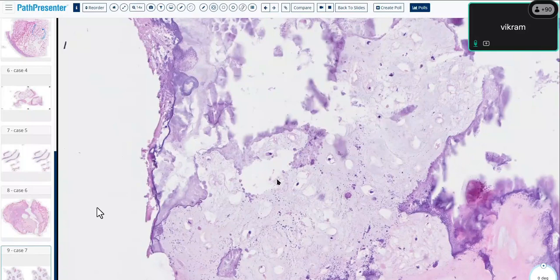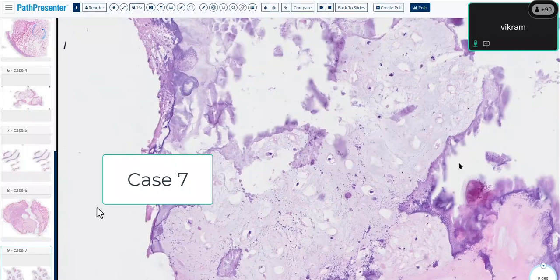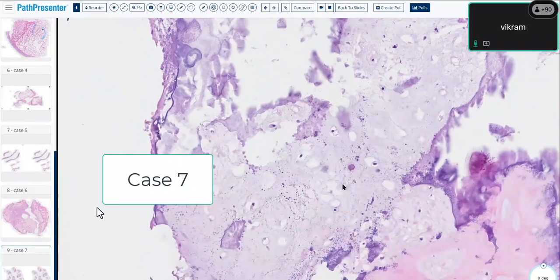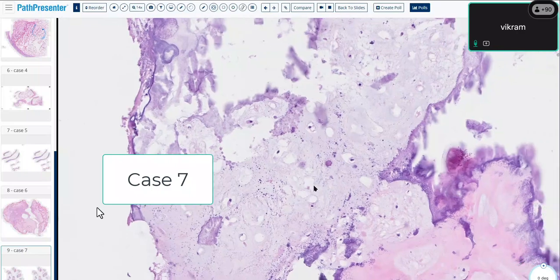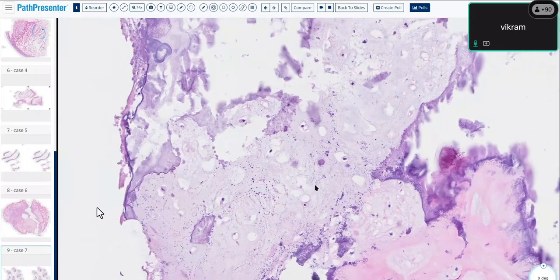I can tell you that the radiology was a very aggressive lesion. This was a proximal humerus lesion in a 70-year-old something patient. So enchondroma, chondrosarcoma, fibroblastic osteosarcoma. I think you're all right. There's no one wrong. I think it's a bit of everything. Chondrosarcoma. There is encasement. I agree with you. So the weird thing is that no one's wrong here. It's like that story of the elephant, right? It depends on what you're looking at, right?